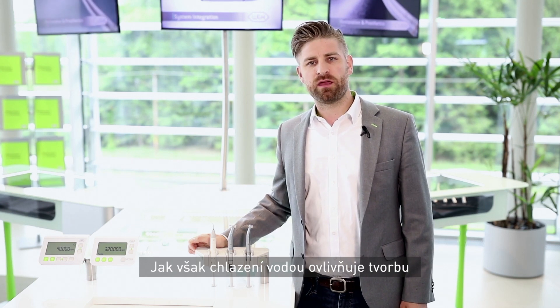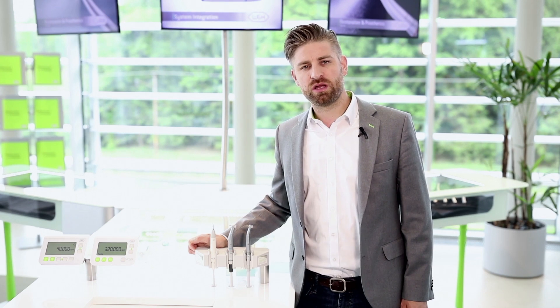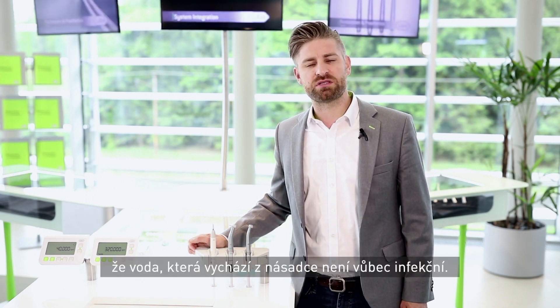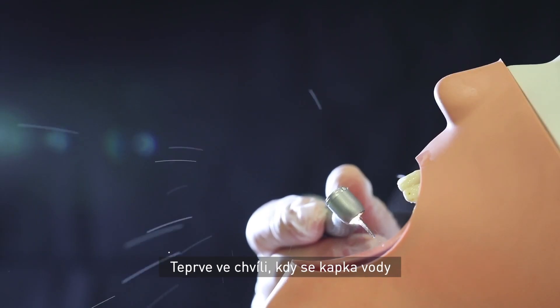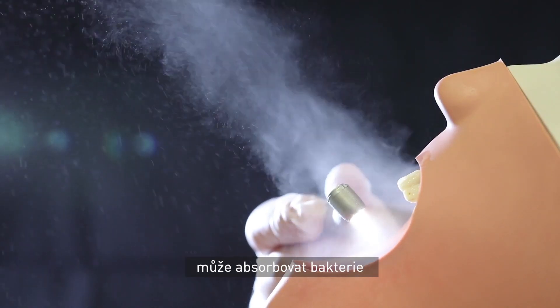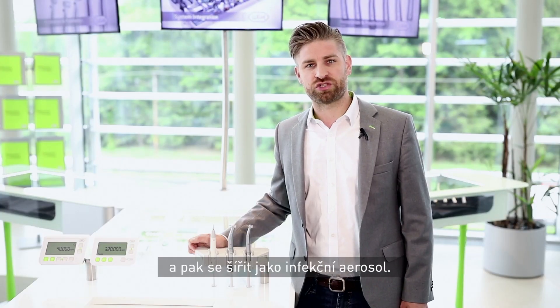How does the water spray affect the formation of potentially harmful aerosol? It's important to understand that the water as it comes from the handpiece is not infectious at all, as long as the quality is ensured by the delivery system. Only when the water drop gets in contact with the patient, it could have absorbed germs and then spread as infectious aerosol.